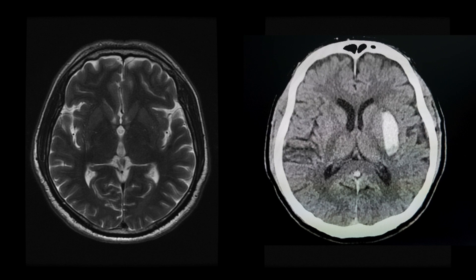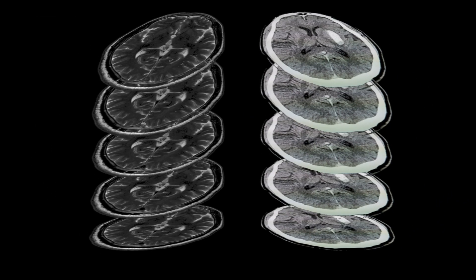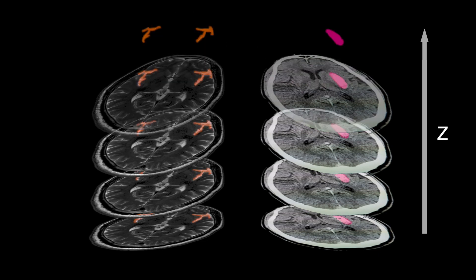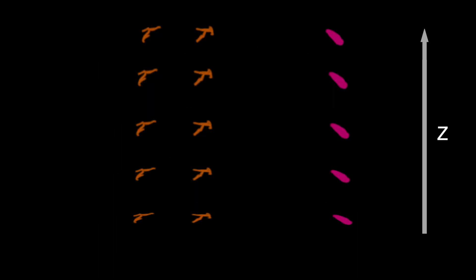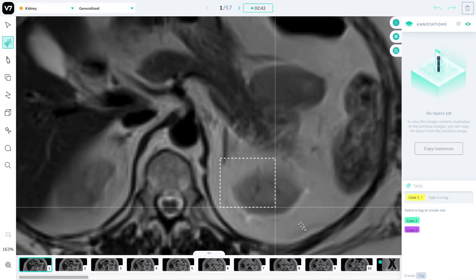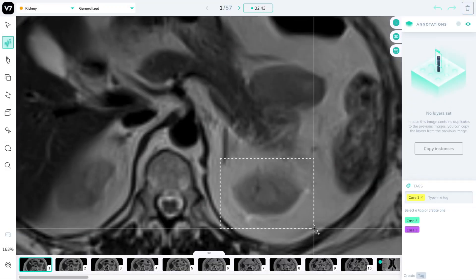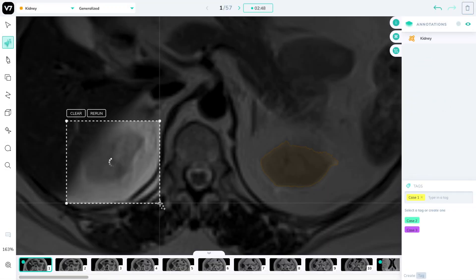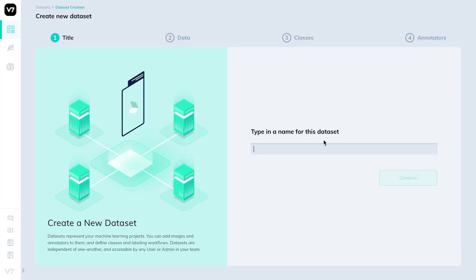MRI and CT are a form of planar slice data, meaning that ultimately there are a series of slices, and if we want AI to learn to identify objects within them, we need to embed these objects within each slice. I'll be demonstrating how to do this on v7 Darwin, covering image segmentation of an MRI and a CT scan.